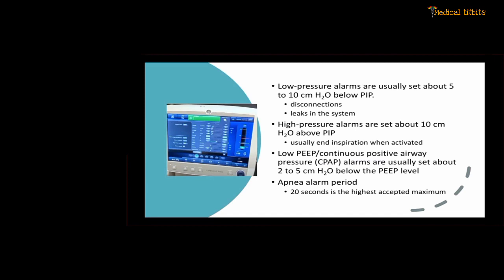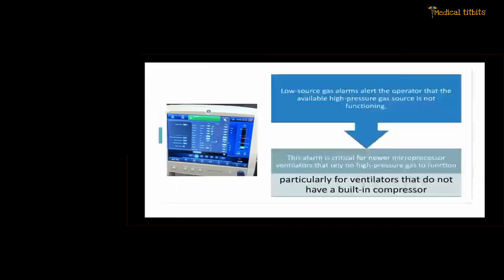The biggest problem in our ICU is the junior doctors or staff members getting tuned to the music of these alarms, and they try to disregard or ignore these alarms. This is not a practice to be supported at all. In every case you need to have sensible limits set in your machine, so that whenever the limit is exceeded, you get alerted, and you do something to avoid that alarm coming again.